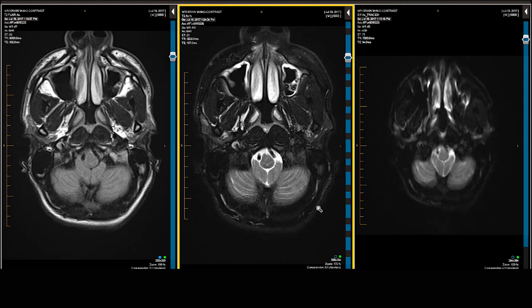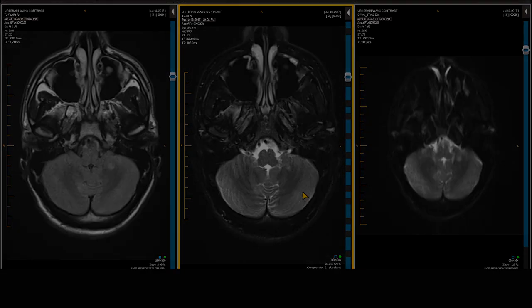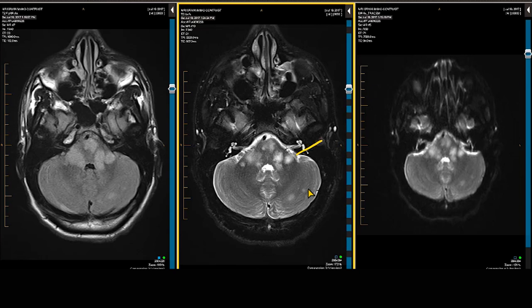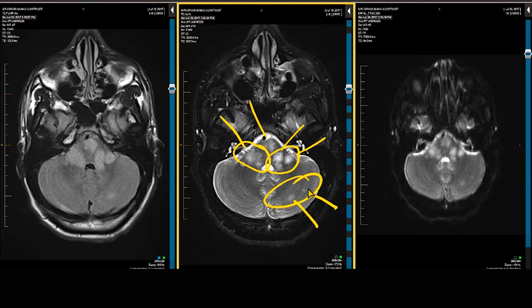Focusing initially on the axial T2-weighted scanning, we are seeing multiple white matter lesions coursing through the brainstem, as well as affecting the middle cerebellar peduncle, which is the main tract connecting the pons to the cerebellum. We are also seeing more peripheral white matter lesions in the left side of the cerebellum. These cerebellar white matter lesions may be better seen on the T2-weighted scan than on the FLAIR scan.